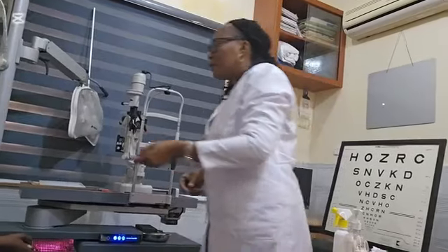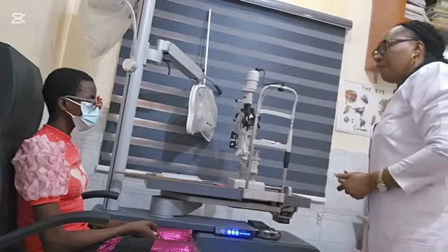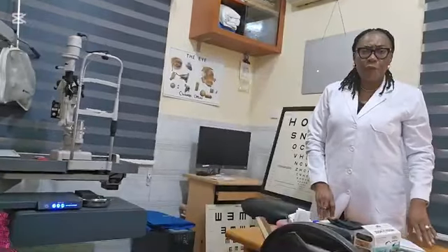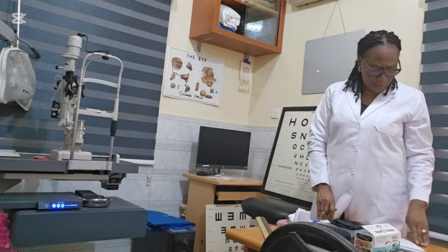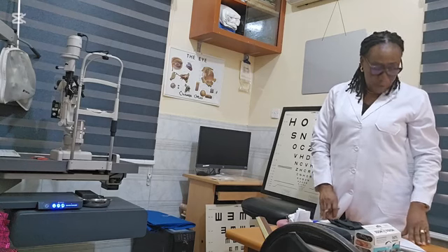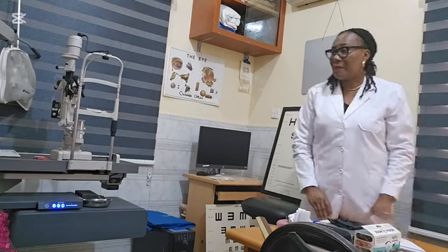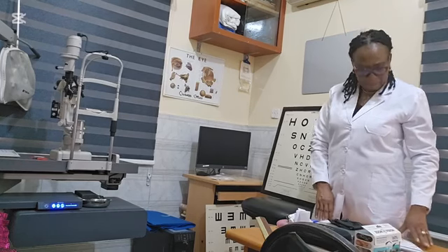So let's do the subjective refraction now with what we got from our retinoscopic findings. So go ahead, read please. Some degree of astigmatism. This will require dispensing a spectacle prescription for her for distant viewing. However, we'll have to do a cycloplegic refraction that will aid us to refine the final power she will need for distant view. So we now have to calculate magnification first at distance and also at near.